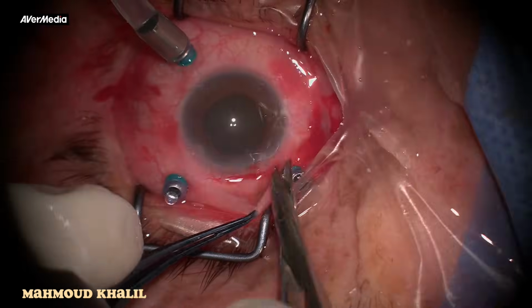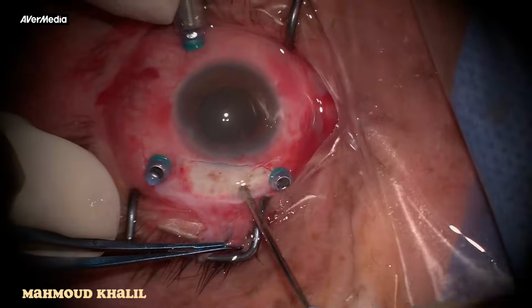While going for shaving, I observed something lustering at the periphery. Going for a cutter and grasping it, it is a foreign body. Then opening a pars plana incision and removing this foreign body from outside.